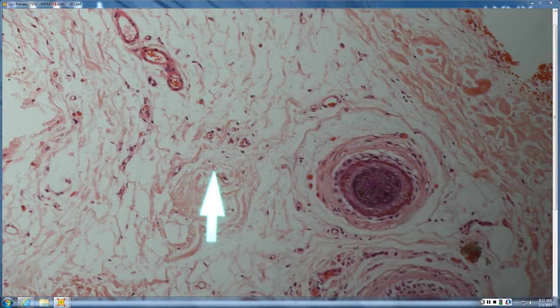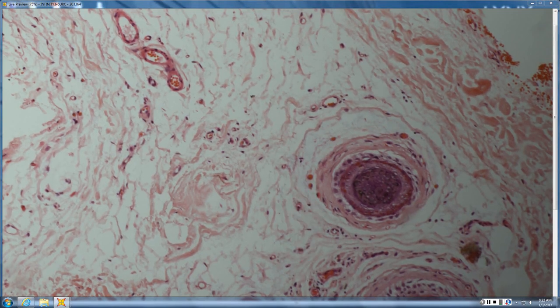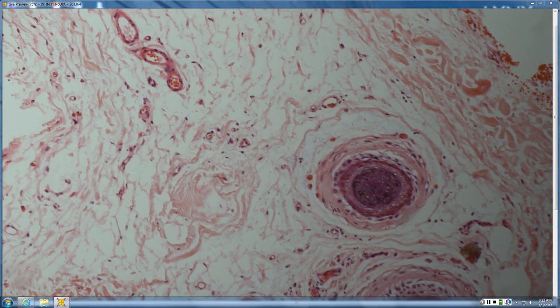Are those EOs or necrotic keratinocytes? I'm not sure. There's a lot of pink. Oh, little blood vessels, just little capillary-sized blood vessels. But if EOs were present down there, that certainly would lead you towards alopecia areata or syphilis. In this case, it's a non-scarring alopecia with miniaturization. You've got to keep all of those in mind.